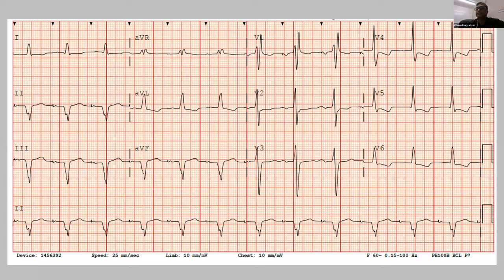Does it make sense to think that this was primarily a sinoatrial problem, or is it an AV problem? I think Tushar kind of went that path, and Rafique Bhai kind of pointed to that. And that was also our thinking, that there was a significant sinus issue, sinus bradycardia. And then it looks like the ventricular mechanism was probably junctional. Because of the underlying conduction, it appeared as a wide QRS, but it was probably junctional. So we put in the dual chamber and the patient did okay. Any comment?